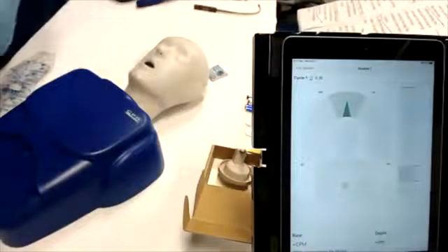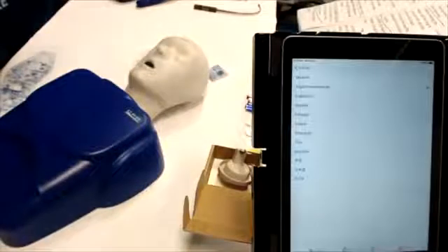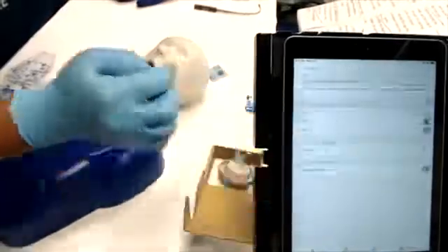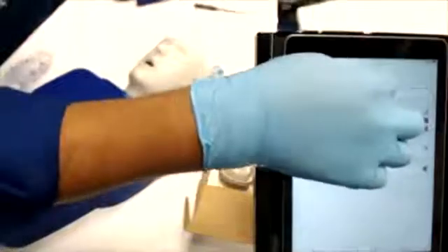The settings icon allows for a language change, 8 language options, including English. It has score calculation where the parameters can be adjusted for compression depth, recoil, and rate. Volume or breath score can also be adjusted, as well as hands-off time.